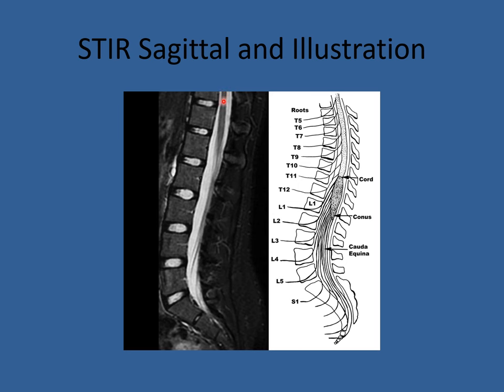The lateral view demonstrates the cord, which ends behind the body of L1, and you can see the individual nerve roots of the cauda equina. The CSF is in the canal. Depending on whether you're looking at a T1, T2, or STIR image, water can be white or black. These are the vertebral bodies and disc spaces. Anteriorly, you're going to see the aorta and great vessels coming down, as well as the organs, depending on the collimation of the MRI imaging.